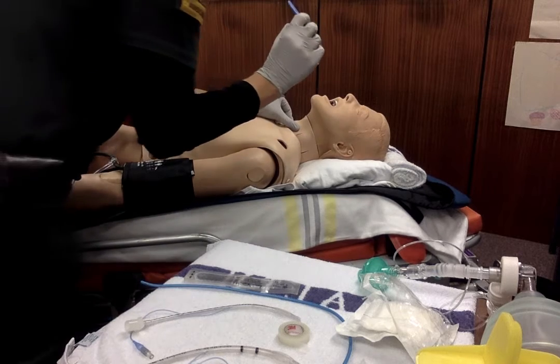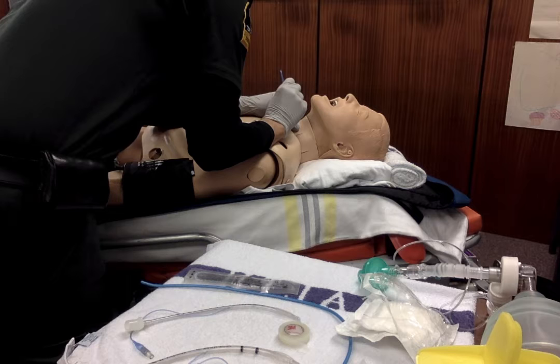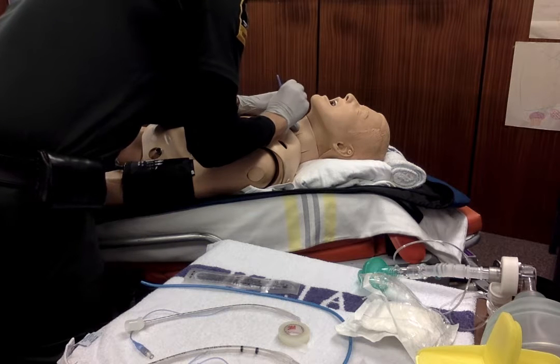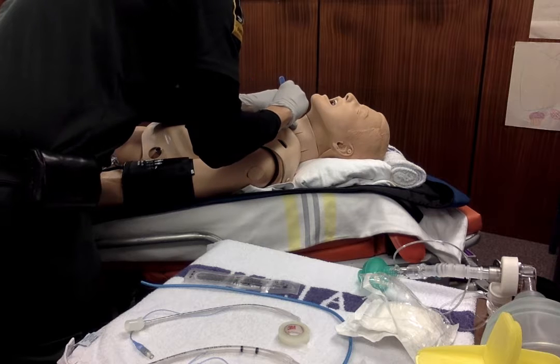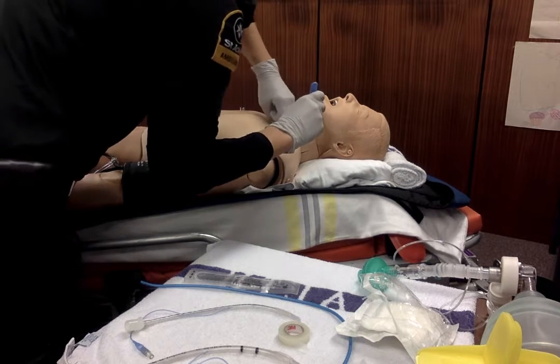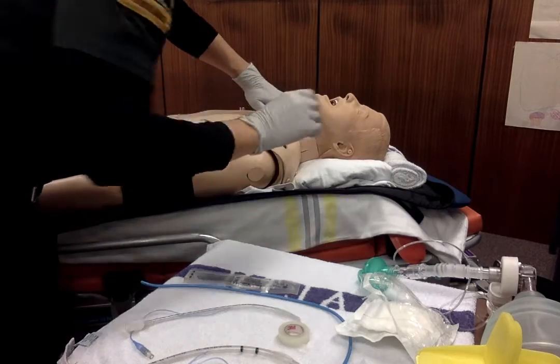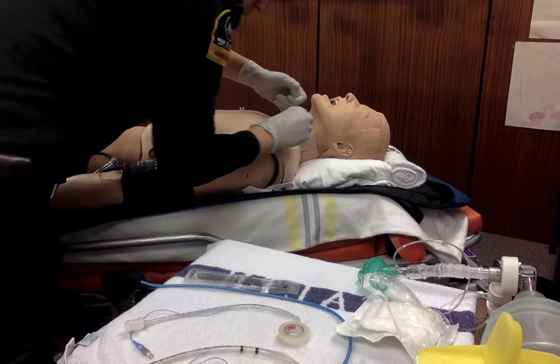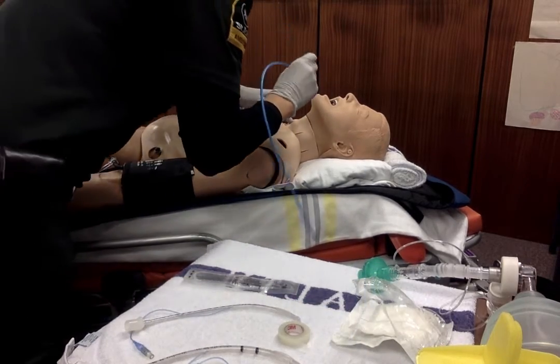I'm going to take the sharp blade and pierce the membrane on the side, and we can twist it to the bottom to make an opening. And then without losing our spot, we're going to try and get our little finger and just open it up slightly to get into the space.